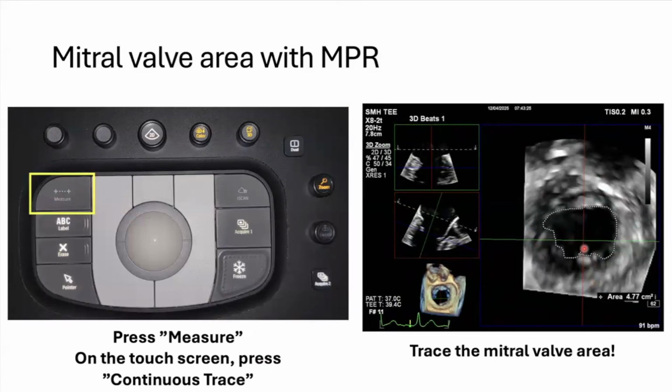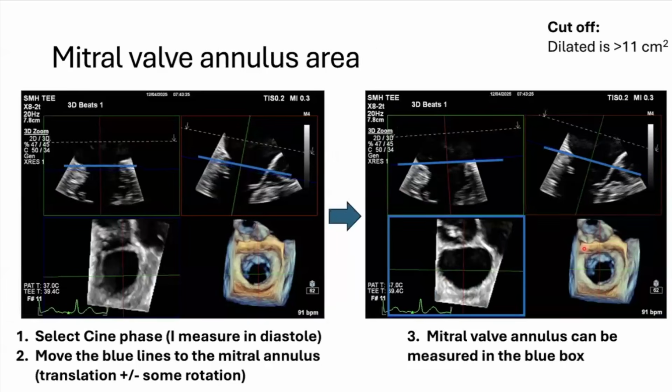And so don't worry if not all of this is sticking right now. One of the benefits of having this on the YouTube channel is this will be something that people can go back to if they want to review how to take these measurements.